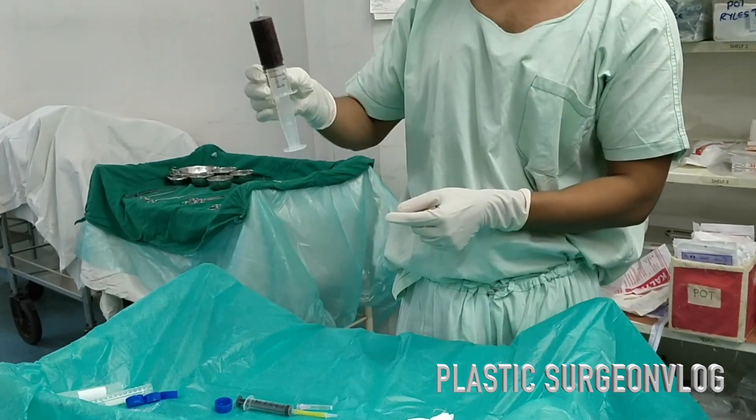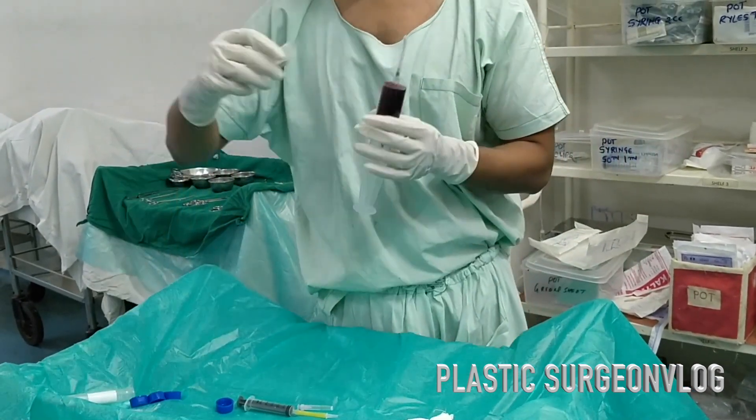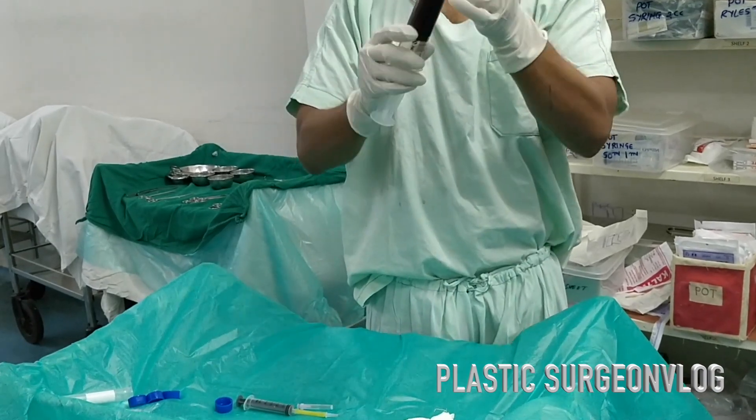In this video I am going to show you how PRP is prepared for the treatment of hair loss.